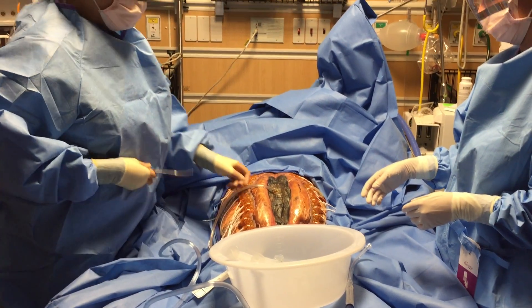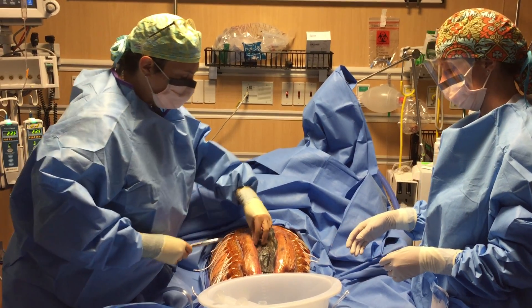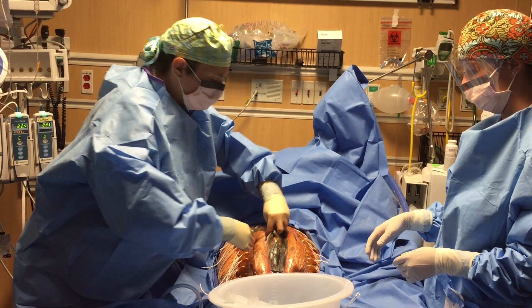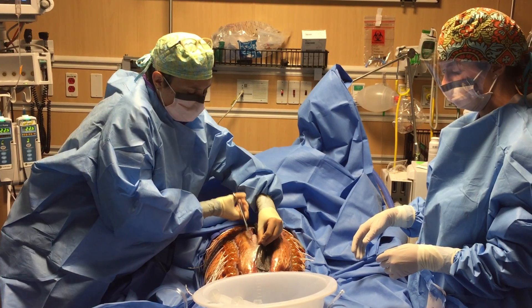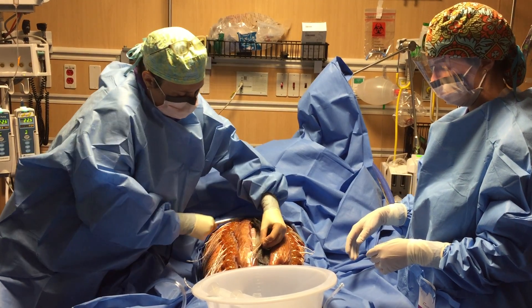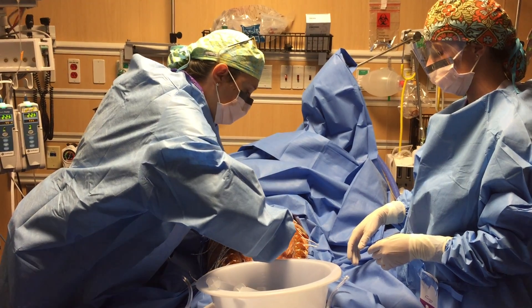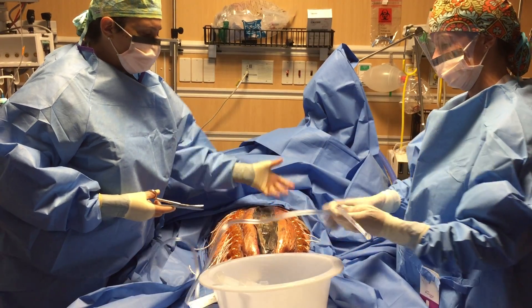We need to go ahead and get the wound vac off. What you do is just cut it here. Anna, pull that off for me. Now you've broken the suction — just pull it up, no big deal. You're going to cut it with a pair of sterile Mayo scissors at the skin edge; that's all you need to do. You don't want to take the sterile dressing off the skin edge — it's not necessary and it doesn't alter the function of the appliance. This is actually protective to the skin; you don't want to continuously be pulling sticky dressings on and off the tissue.